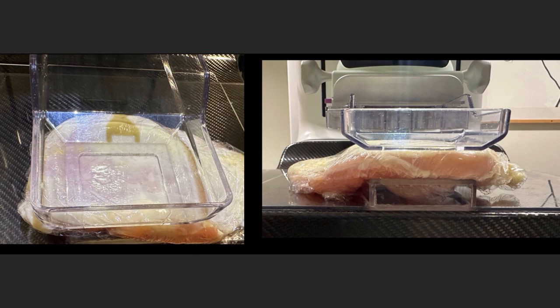So I got some breast of chicken from my local supermarket to demonstrate this because I didn't really want to be having a patient compression and taking photographs of them. But I think it will show it quite right. So we have here, we've got our thin chicken breast. And this is a couple of centimeters thick.